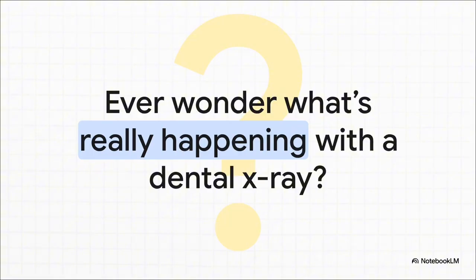It's this wild trip that starts with a tiny, invisible photon, travels right through you, and ends up as this critical piece of information that can literally save your teeth. And our story doesn't start in the dentist office. It starts over a century ago.